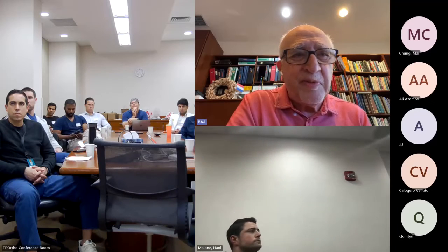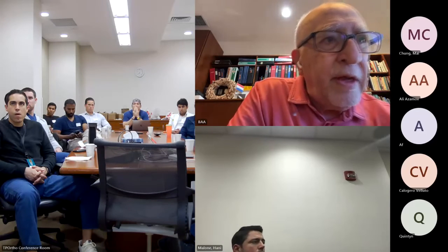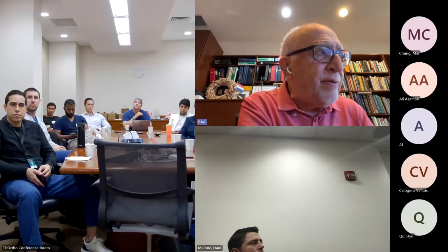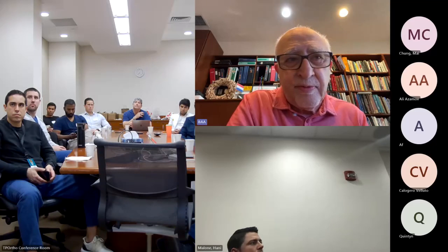We always had this discussion, but I think you have the ability to correct it segmentally even more, like doing an ACR or other procedures, which is hard to do otherwise. And I never was able myself to look at the entire disc and make sure that I get a good fusion. So I think hopefully, as you mentioned, there's not much data. I would hope that with the advancement of technique, you should be able to do both.